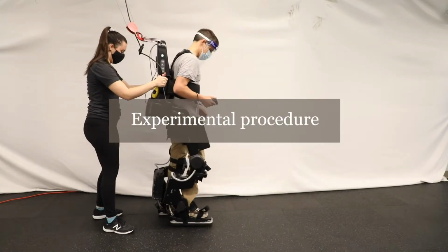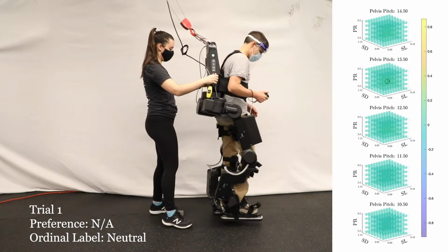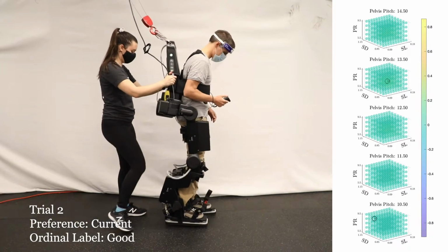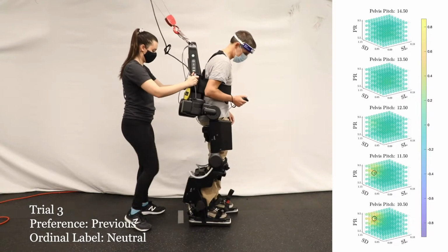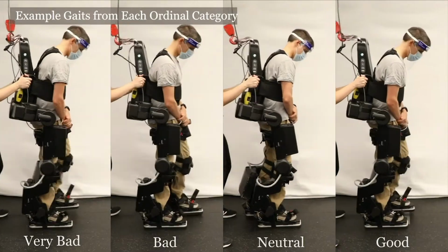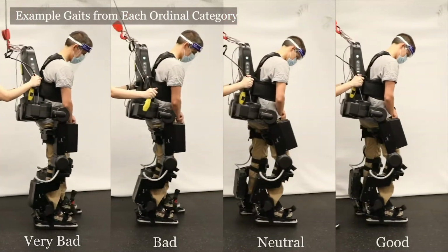At each iteration, ROIAL selected a new exoskeleton gait for the user to test. The user was asked to give that trial one of 4 ordinal labels: very bad, bad, neutral, or good, and then asked whether they preferred the previous or current trial. This process was repeated for 30 iterations. Here are example gaits in each of the 4 ordinal categories for one of the 3 subjects.